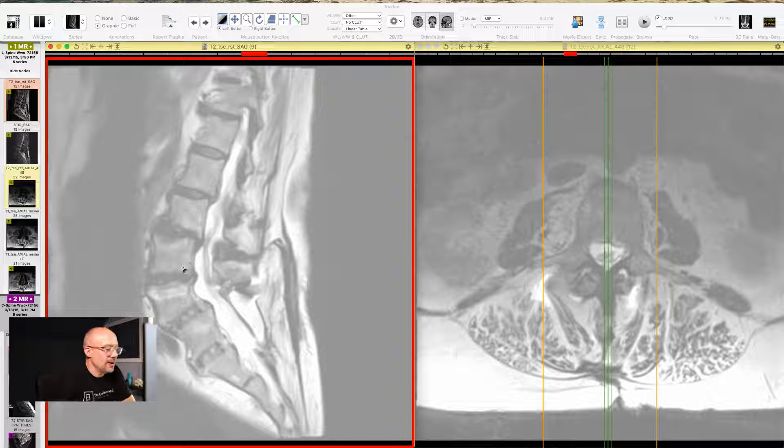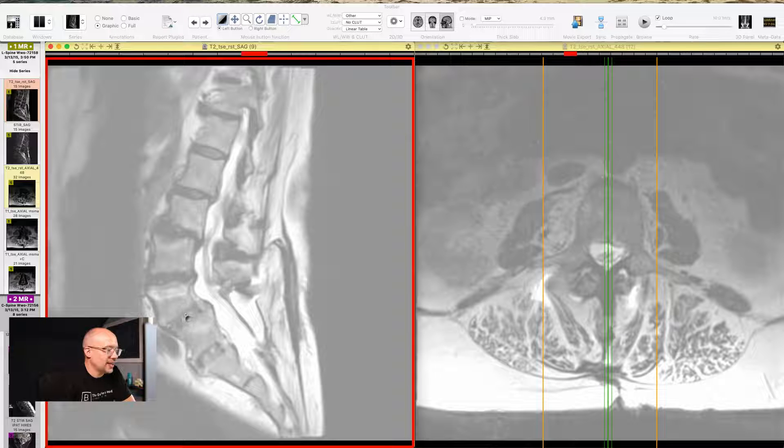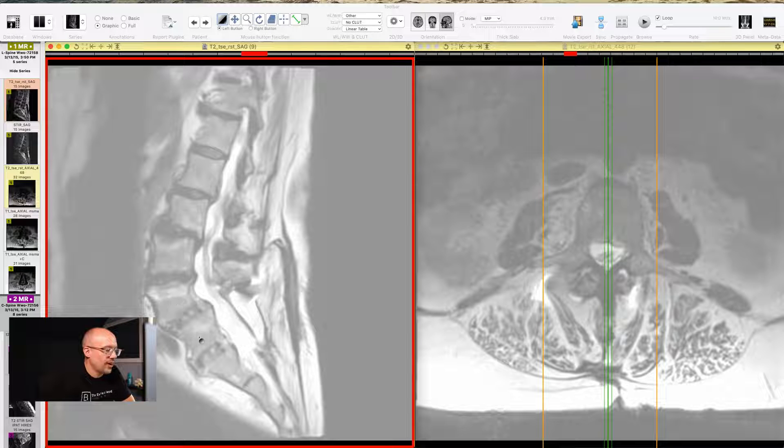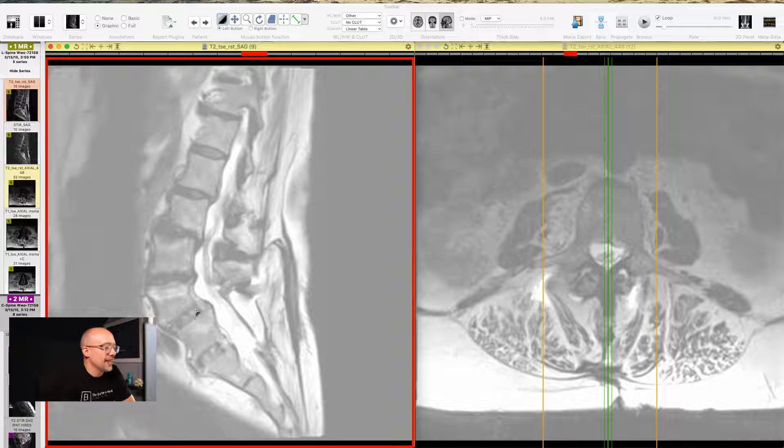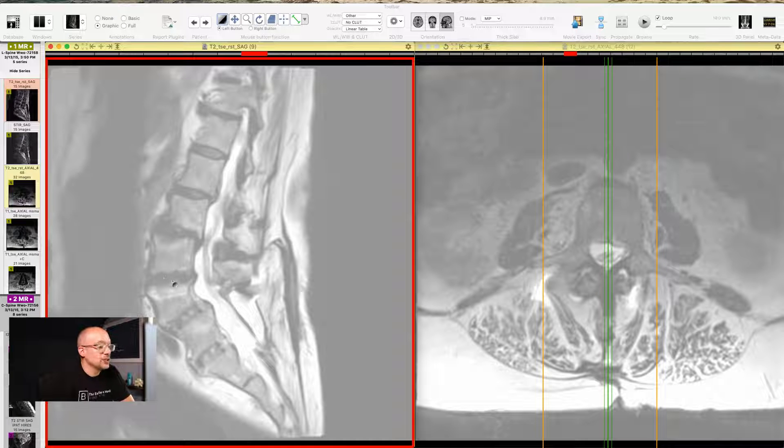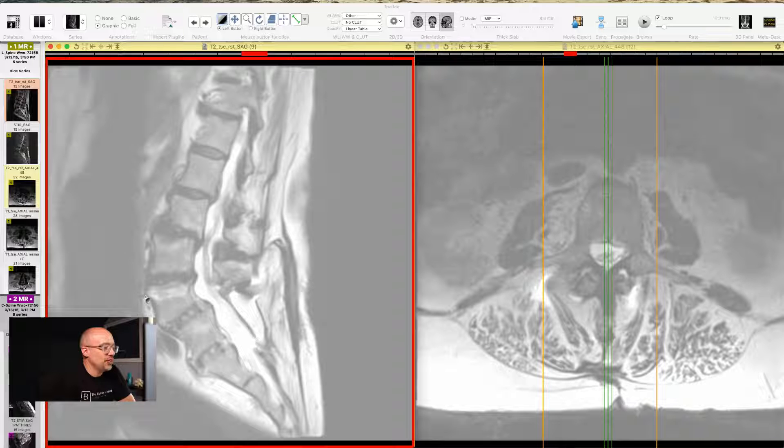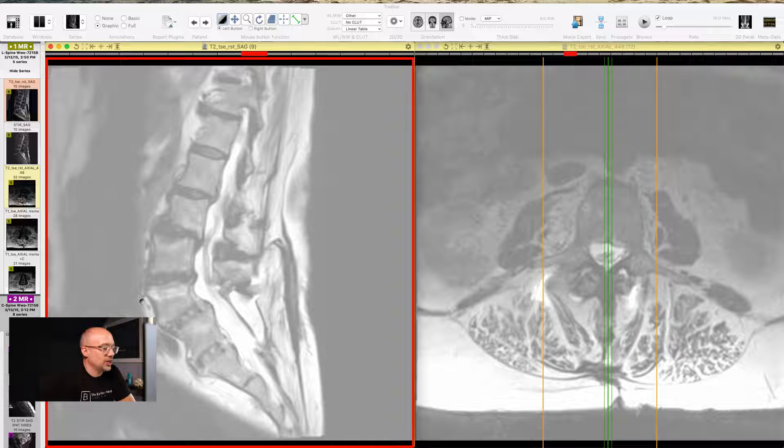The other thing that you might be taking a look at and saying, gosh, at L4-L5, we're on the left hand side of the screen, that disc looks a lot different than the others. And that is because it's not, it's no longer a disc. That is where a previous fusion, watch when I scroll to the side a little bit.